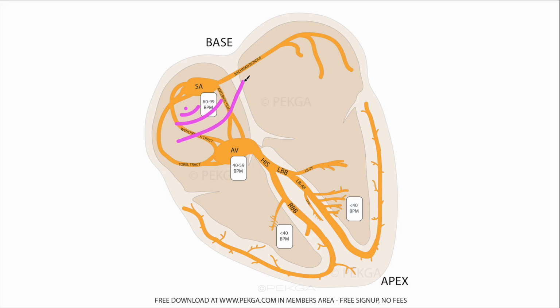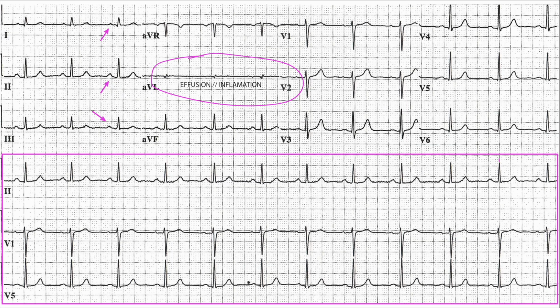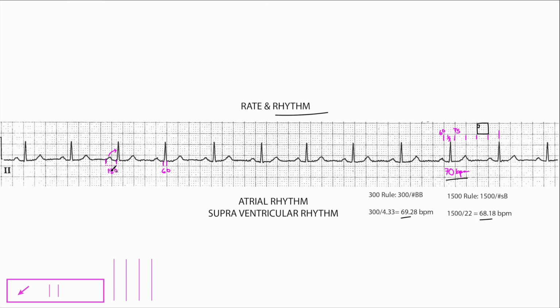So the signal would propagate through the heart in almost identical fashion to what the signal would look like coming from the SA node. There would be virtually no distinction. However, if you were to take a look at that on an ECG, especially a single lead, there's no way you can tell that.